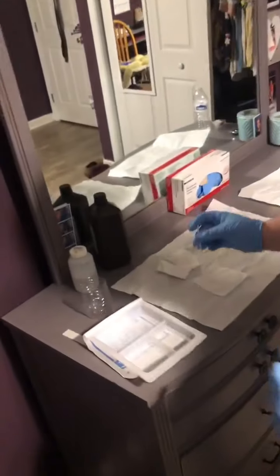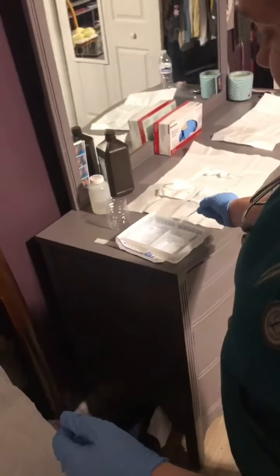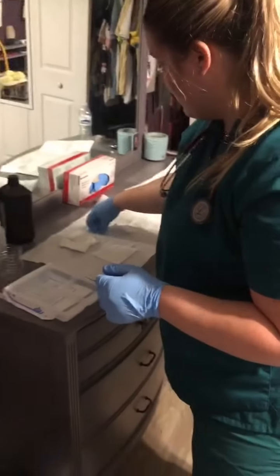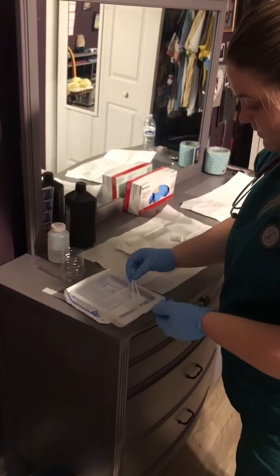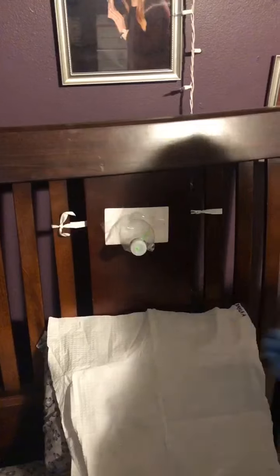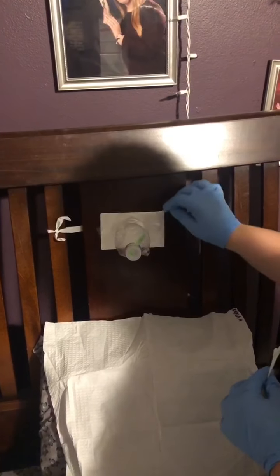So the normal saline that I have not used yet, I'm going to dip it in there, and I'm going to clean from the center outwards. Center outwards. And then I'm also going to clean the faceplate.